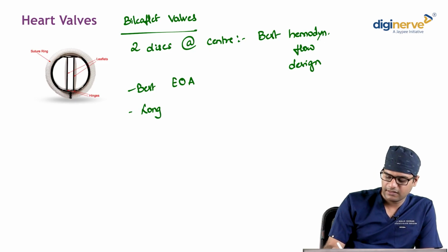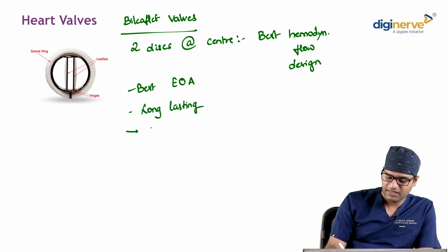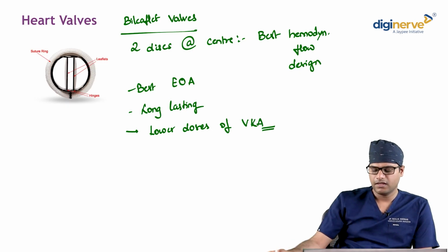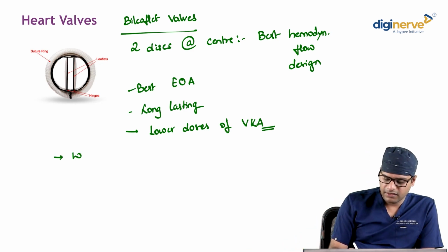Long lasting again. The newer generation valves, because of their better coating, have been able to sustain with lower doses of vitamin K antagonist. All over the world, it is the widely used type of mechanical valve.